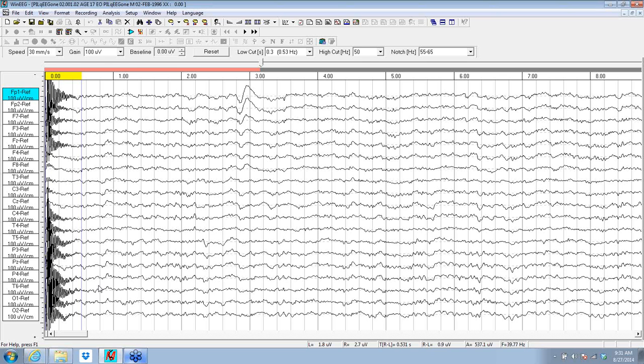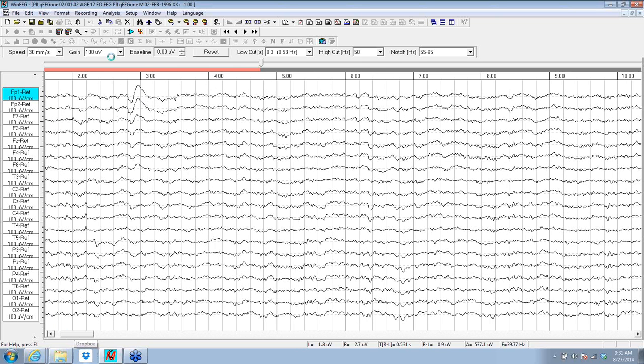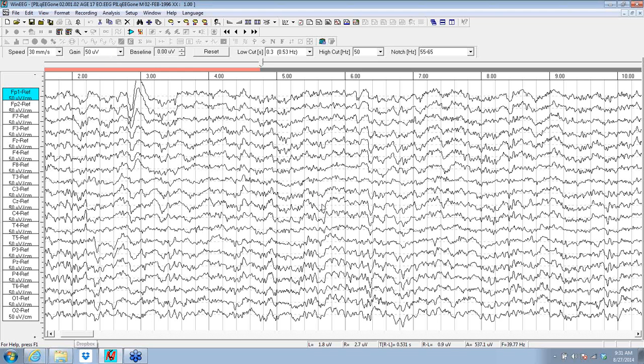The medical standard says you've got to be able to recover the raw EEG, not the filtered EEG the way you looked at it, but the raw EEG, so people can look at it from scratch. But at this point, we do see the eye blinks. The EEG at normal recording sensitivity actually has some buzz of faster activity, beta frequencies in it. But CZ particularly has a slower feature.